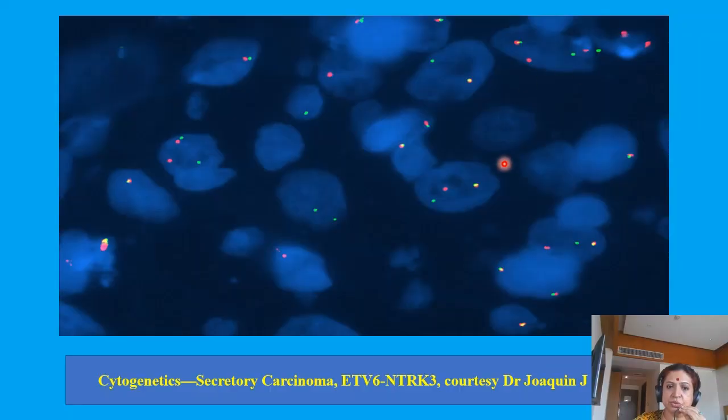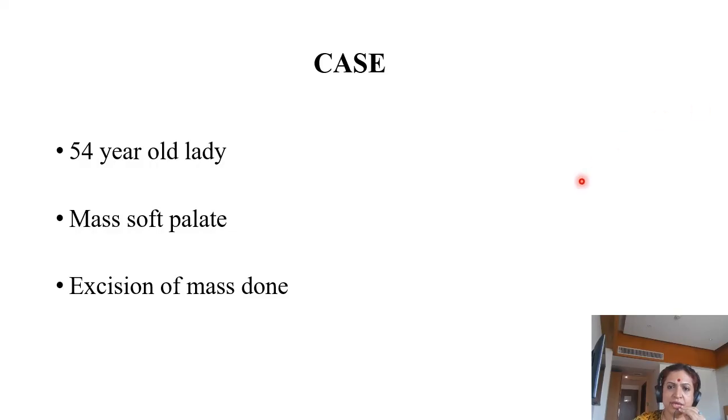And this is the cytogenetics of secretory carcinoma, shared by Dr. Garcia from Mayo Clinic. Now we'll wind up this lecture with a case. A 54-year-old lady who presented with a mass in the soft palate, and excision of the mass was done.